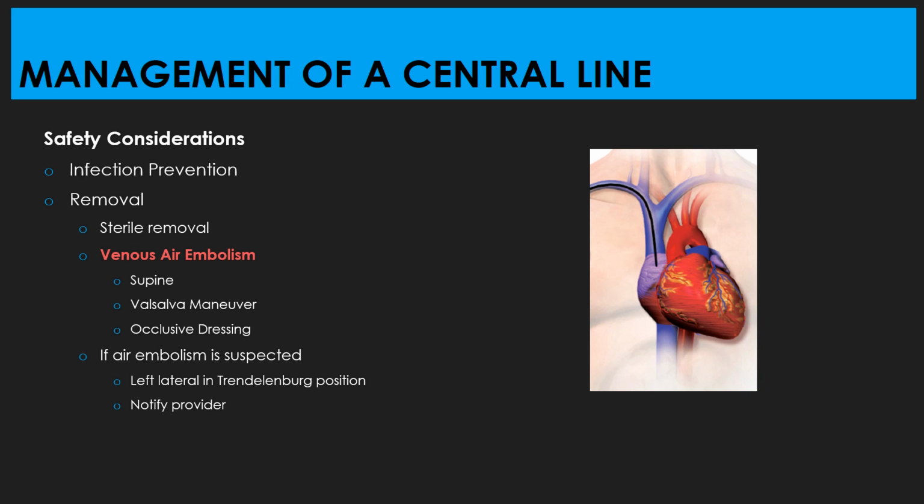Think about the infection prevention strategies that you've already learned when handling central lines. So good hand hygiene, scrubbing the hub, keeping those green Curos caps on the ends of the catheter hubs when they're not in use. Only accessing the central line if you need it. Keeping the lines clamped when they're not in use. We do not want this patient getting an infected line that is going right into their heart.